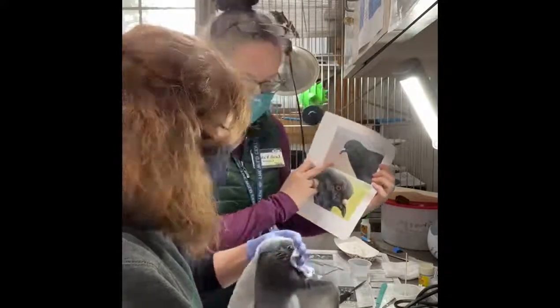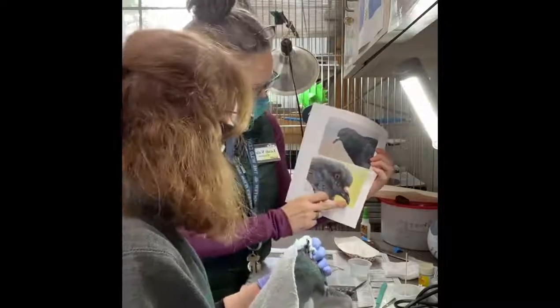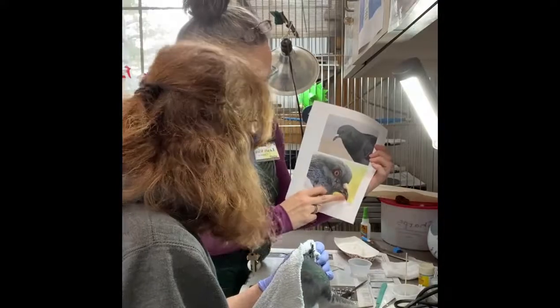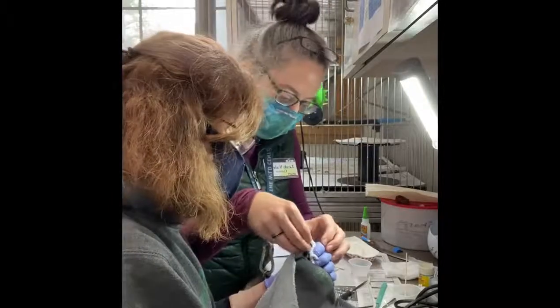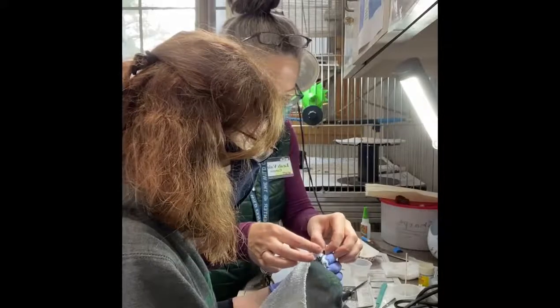It's supposed to be that pointed — I think so. And it's at the top. The top comes down a little, but I think the length looks normal. So what I want to do is just glue this on there — this is a little too long and I'll just form that afterward.